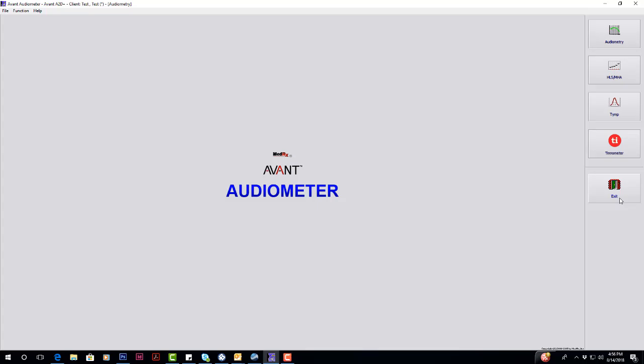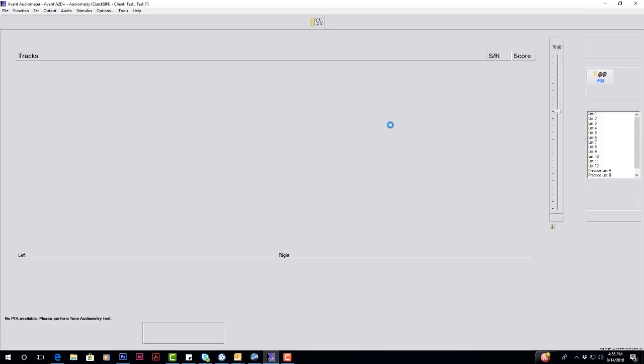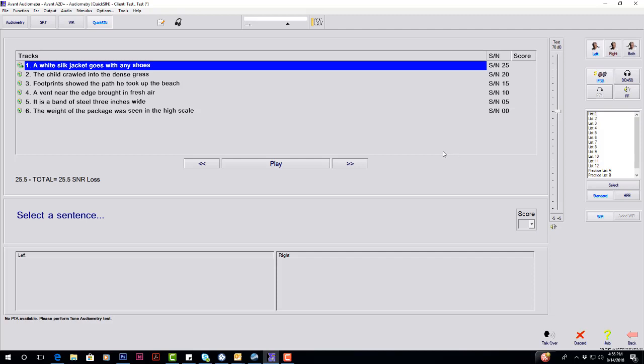Next, we have QuickSIN. So QuickSIN is built in all of our new audiometers, and it's going to give your SNR loss.